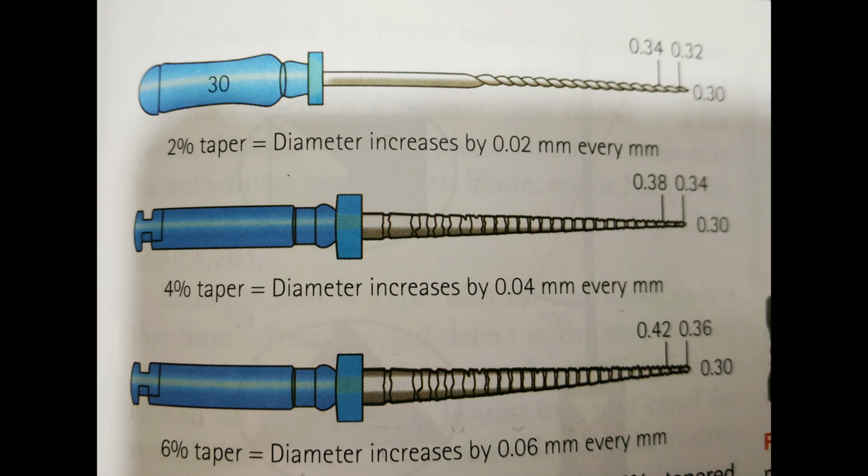So all the endodontic instruments are available in 2%, 4% and 6% taper. You must have heard people talking about this. Taper denotes the per millimeter increase in the file diameter from the tip towards the file handle. So in other words, a number 20 file has a tip diameter of 0.2 mm and would have a 0.22 mm diameter 1 mm from the tip, and 0.24 mm 2 mm from the tip, and 0.26 mm 3 mm from the tip. So greater taper instruments have been developed which are around 4%, 6%, 8% and even 10%.